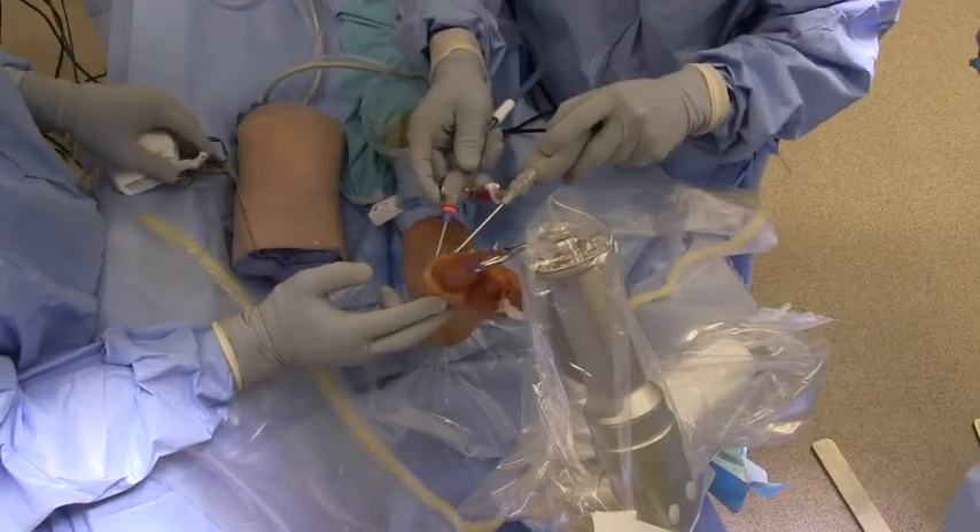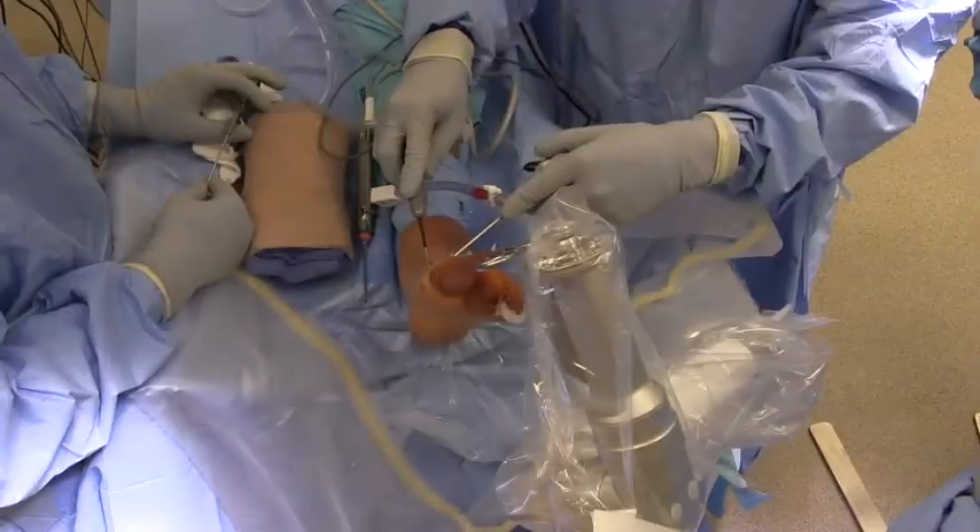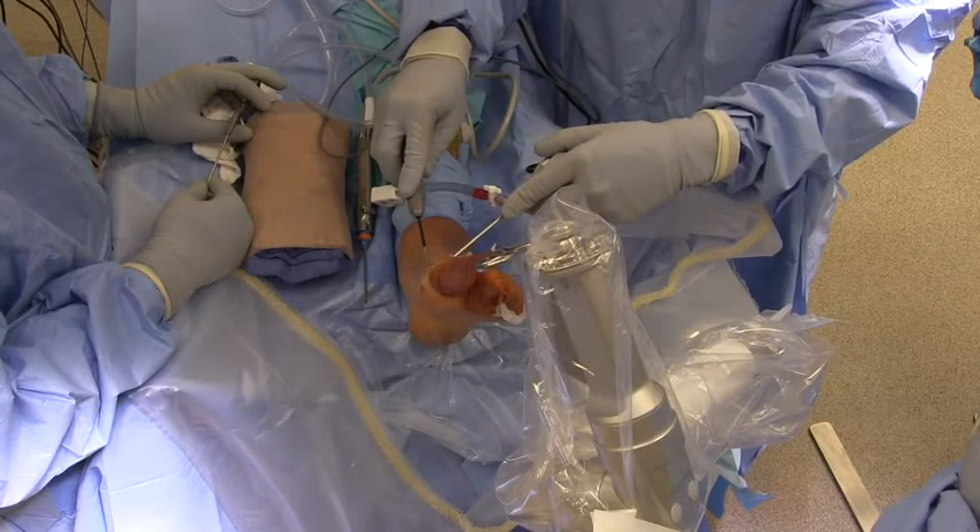We then utilize the 2.5mm shaver to remove any osseous spurs, and then use the 1.9mm electrocautery device to obtain hemostasis.